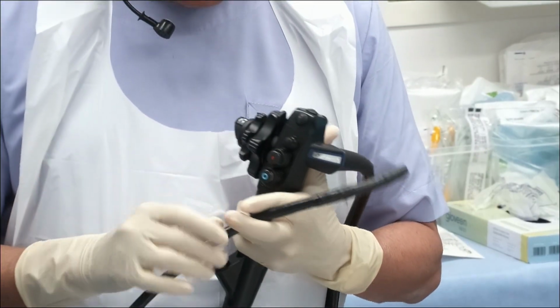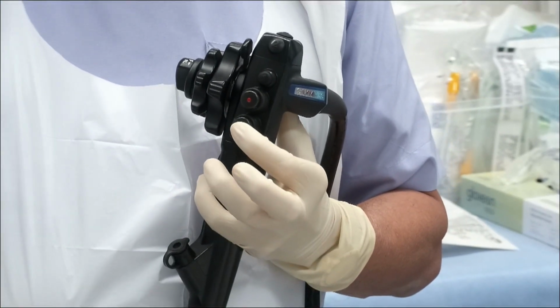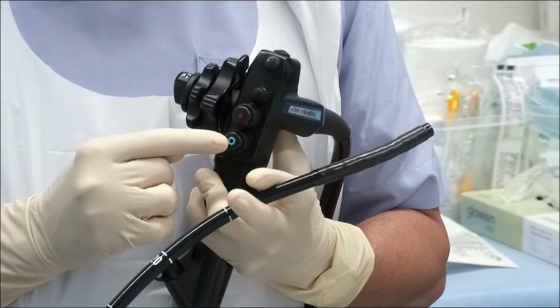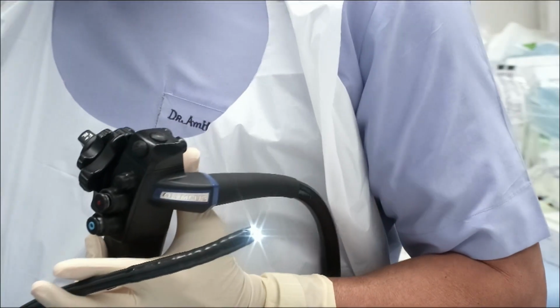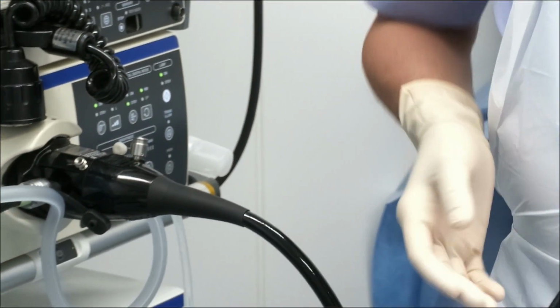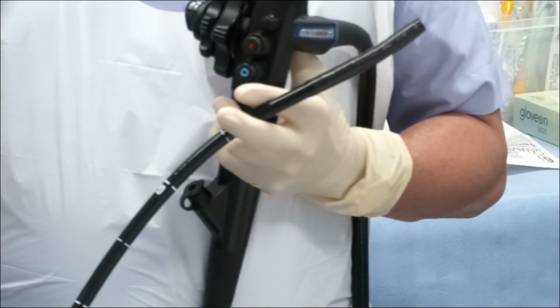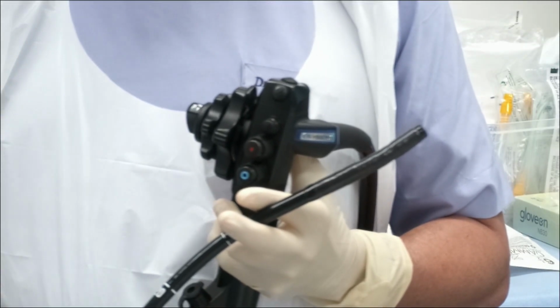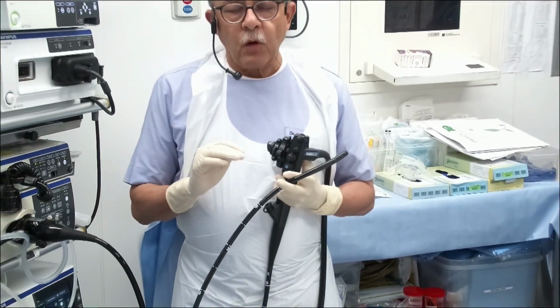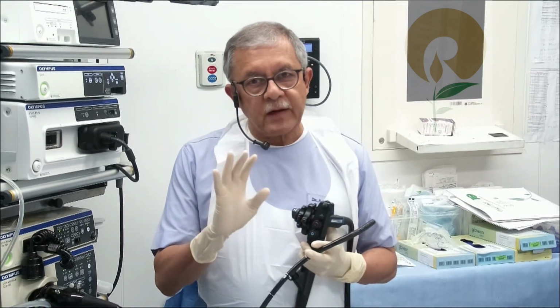In addition to that, you have 2 buttons in front of the endoscope. Now, this lower button, which is marked by blue, is where air comes out from the processor and the light source, which is also supplying air, because the upper GI tract or the lower GI tract are potential cavities. They are not containing air all the time, they contain fluids. So, when you put an endoscope inside the stomach or the colon, you have to inflate it. So, for insufflation, you need to insufflate air.